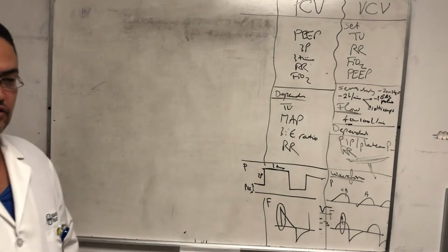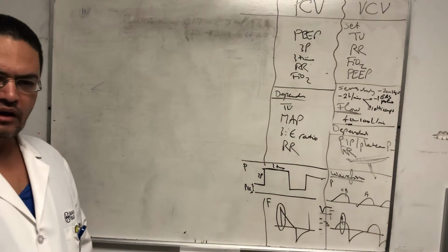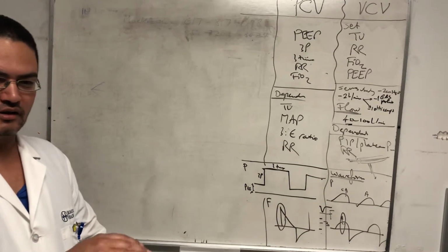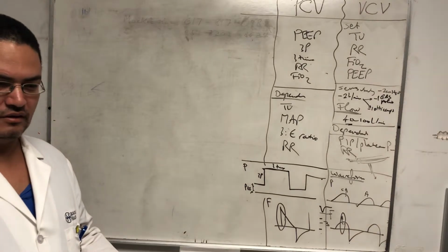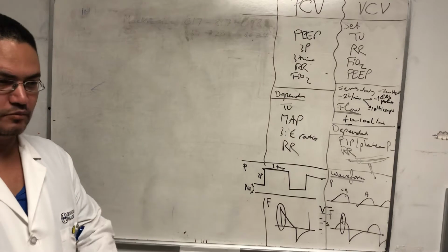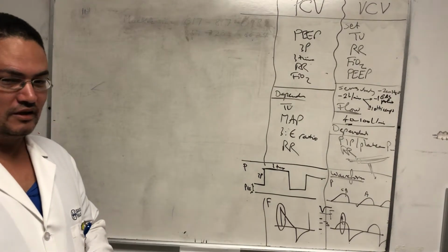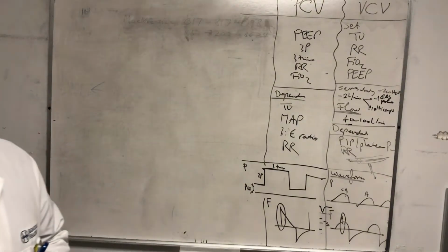But there's a lot of implications for it. For example, in cardiac arrest, we're using CO2 as our indicator. It's for the adequacy of CPR. You press hard, the CO2 rises because the CO2 matches the cardiac output. It's very easy. As long as there is cardiac output, CO2 goes in and out and diffuses.